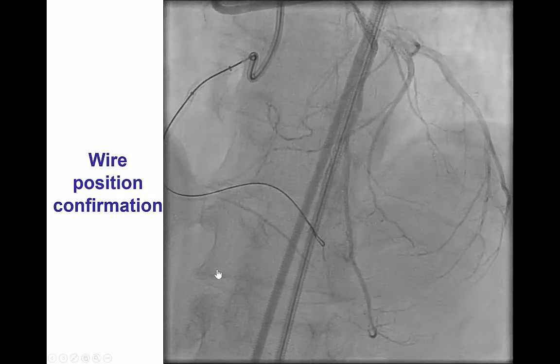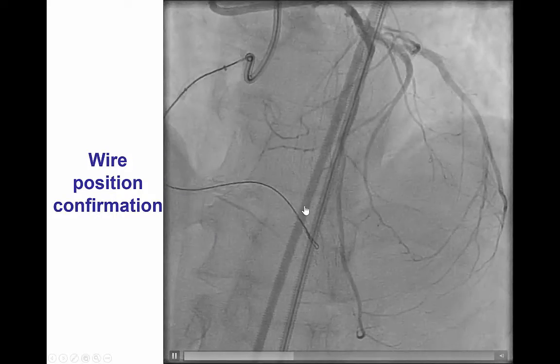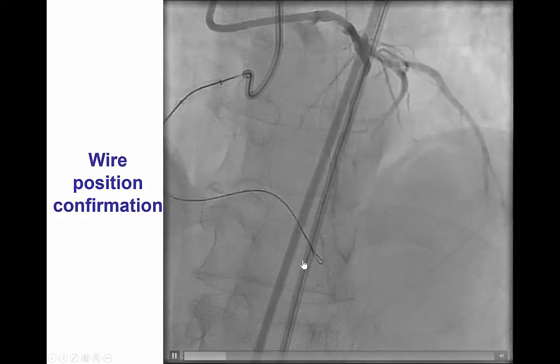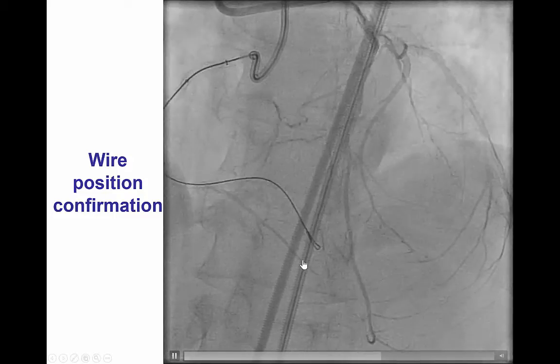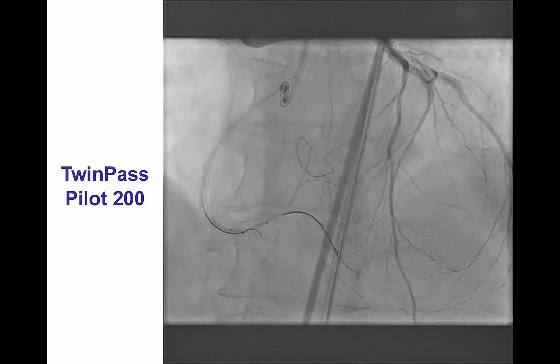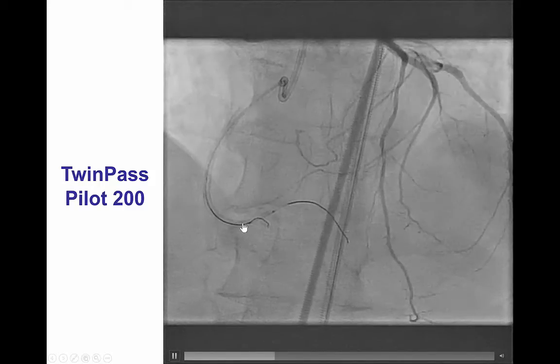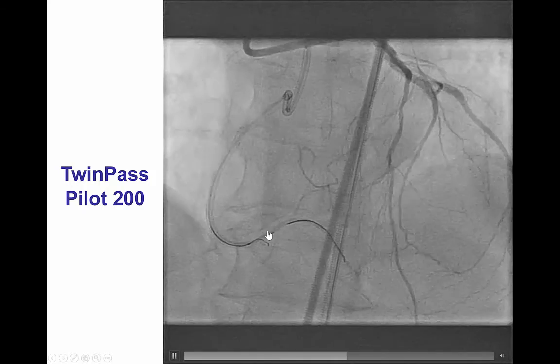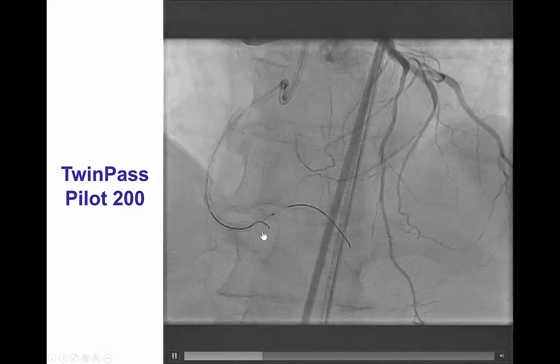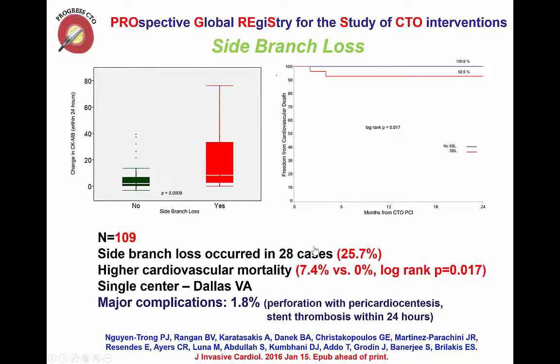Contralateral injection showed that the wire had gone into the posterolateral branch, whereas the PDA remained occluded. We did several attempts to wire the posterior descending artery using a twin-pass dual-lumen microcatheter and several guide wires; however, we were unable to advance a wire into the PDA.